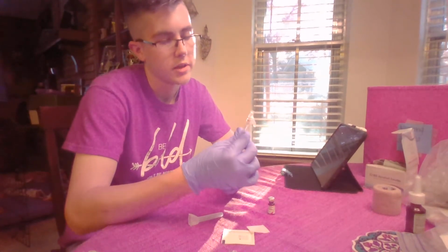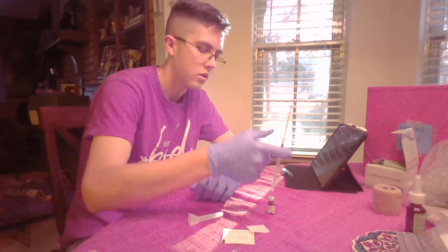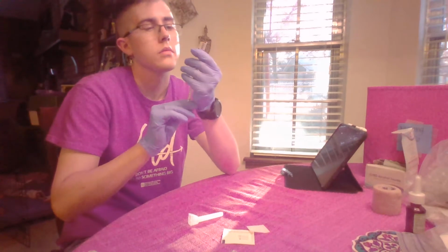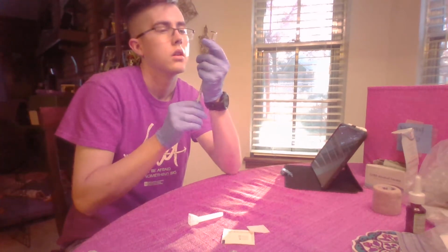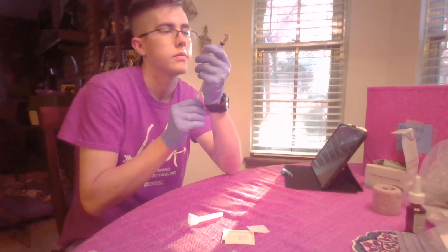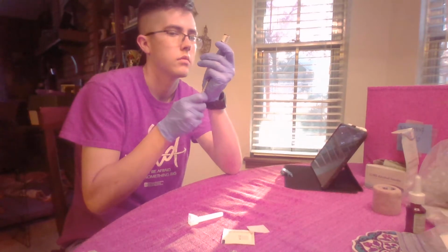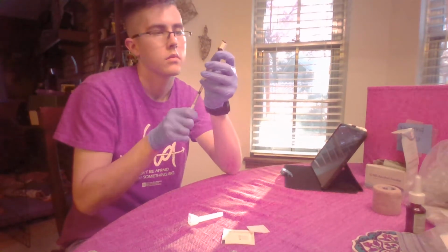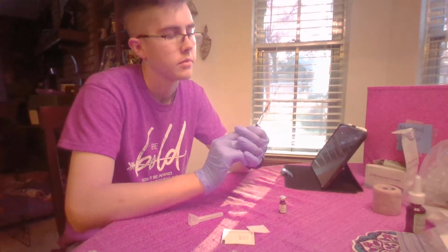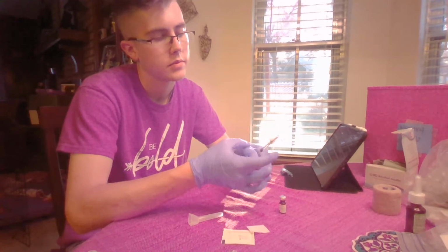Pull back 1 milliliter of air, inject it into my vial, pull it out. Okay, pull out my medication, get all the air bubbles out.